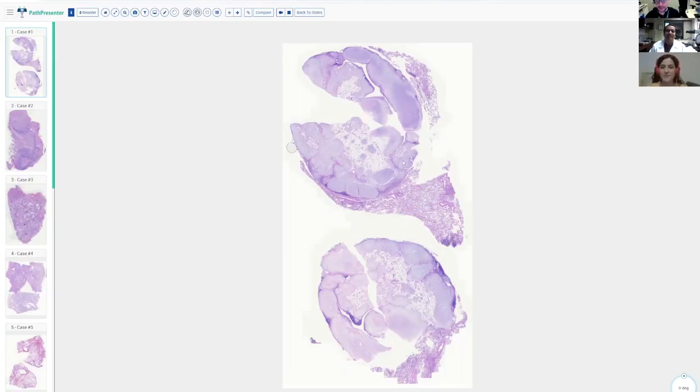Today we're going to do some spotter cases. These are cases that you can diagnose based on just the H&E stain alone in about 1 minute or less. These are types of questions that might commonly appear on in-training exams during your residency training, and are important cases to know for practice as well.